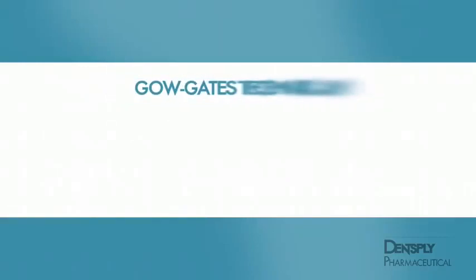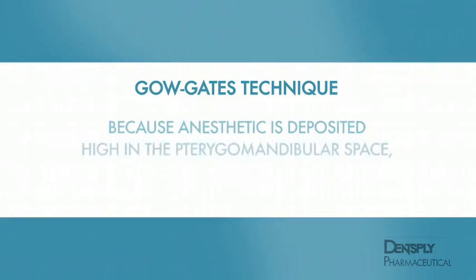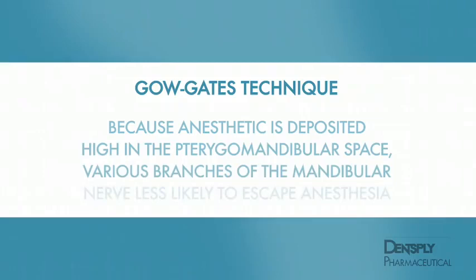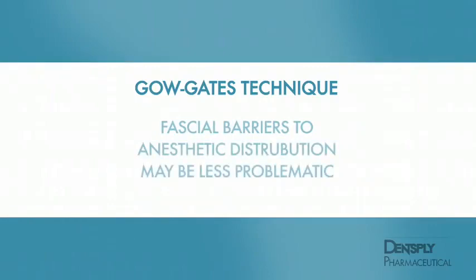When properly performed, the Gowgates block offers some advantages over the standard inferior alveolar nerve block. Because the anesthetic is deposited high up within the pterygomandibular space, it is less likely that various branches of the mandibular nerve, which may provide anomalous innervations of the mandibular teeth, will escape being bathed in anesthetic solution. Also, fascial barriers to anesthetic distribution may be less problematic than with the standard injection.